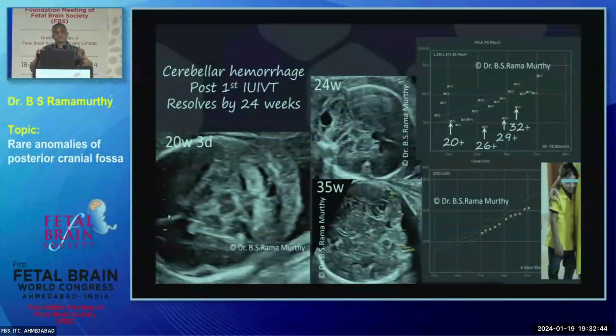At every visit, you come for an MCA assessment, and we measured the cerebellum just like we measured the MCA. And this perhaps is the most measured cerebellum in the world today, right? But we smile and we laugh now, but each time my heart was in my throat when this lady came, right? But the growth was good, no problem. And the boy is now 4 years old, doing very, very well. And this is how the ultrasound went at 24 weeks, resolution, and at 35 weeks, hardly anything. Looks good, although the cisterna magna looks a little, yeah.